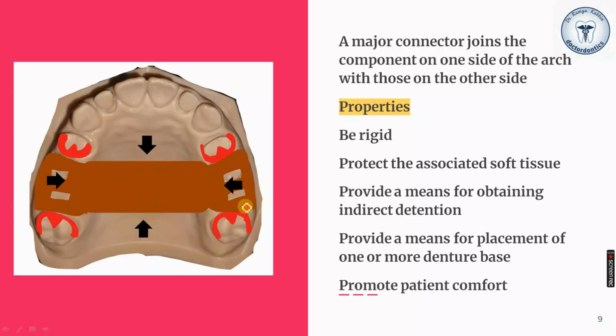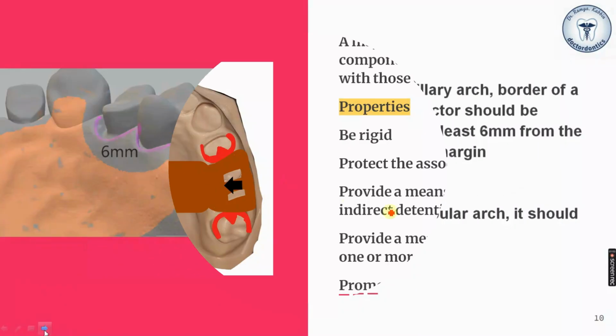These are the denture bases. It allows the placement of denture bases on this, and it will promote the patient comfort because it will have a better proprioceptive response compared to the acrylic.